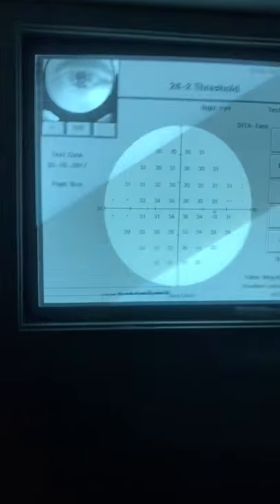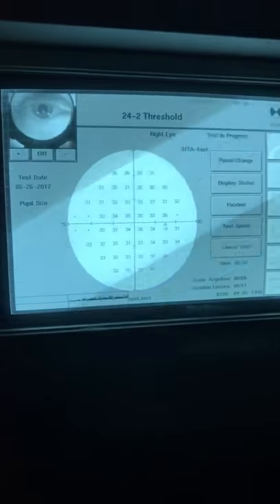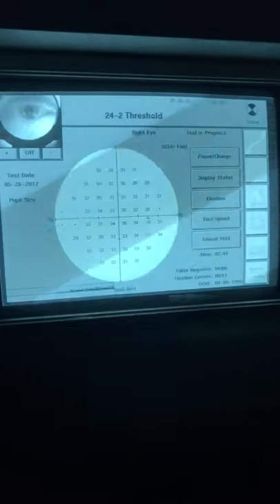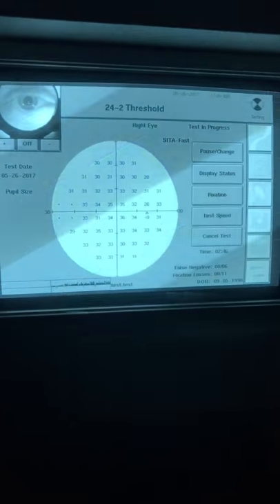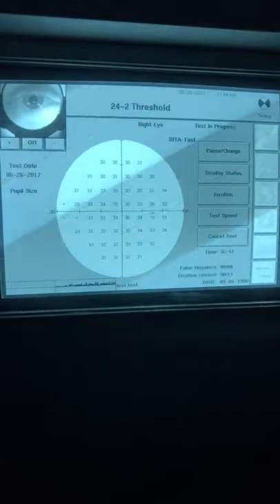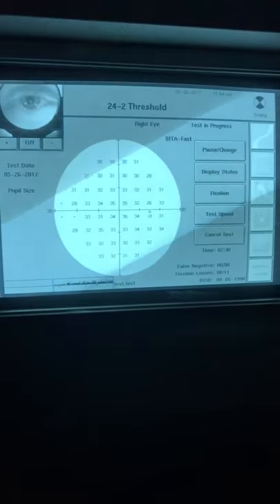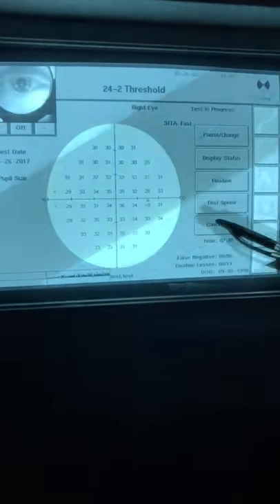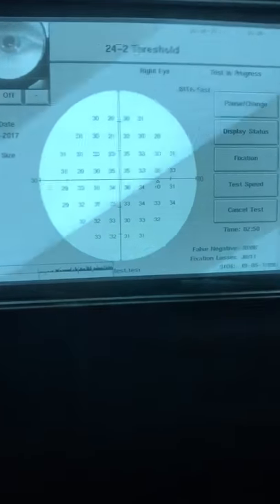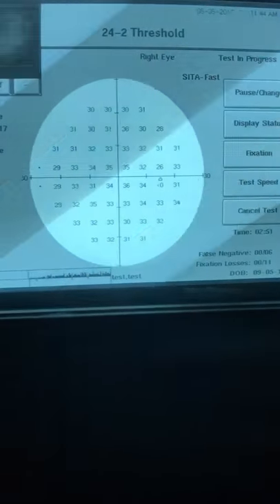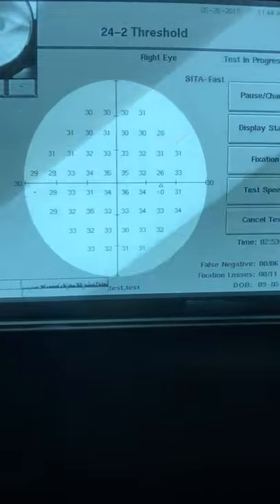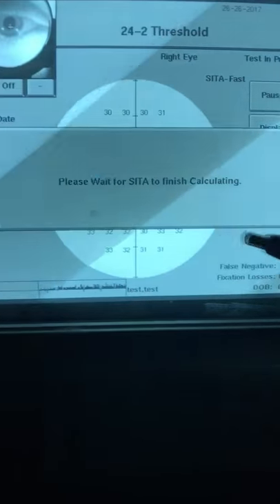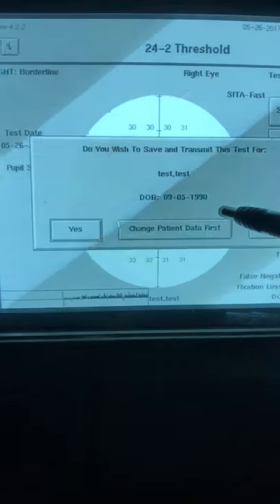This here is our tracking. It tracks all the eye movements. Any sudden movements or shifts in the eyes or blinking, you'll get these little peaks in our tracking gaze right there. The numbers here are the light stimulus in decibels. For each eye, you're going to see one where there's zero.